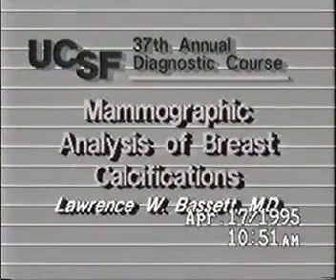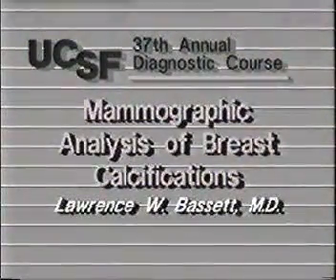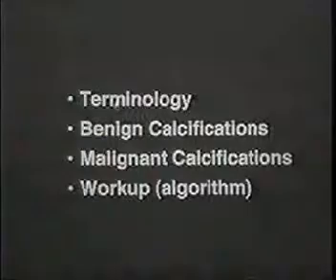A review of the terminology so that we can approach the beginning on the same level. We'll look at benign calcifications, malignant calcifications, and as you've already seen, algorithms are getting popular. I'll show you an algorithm.